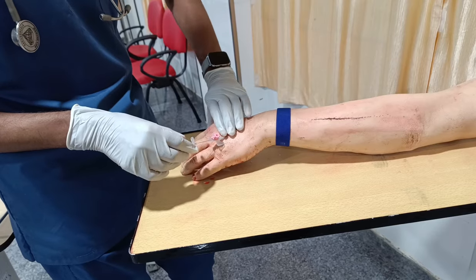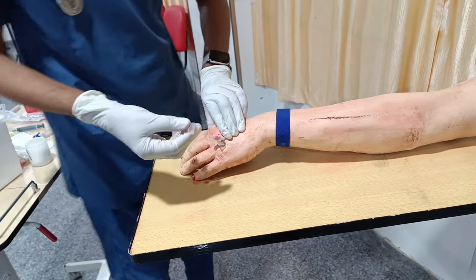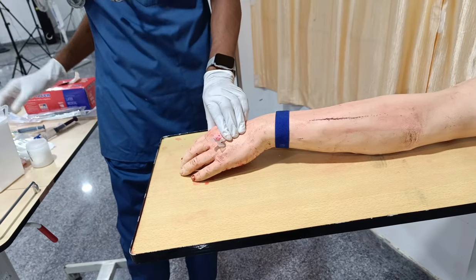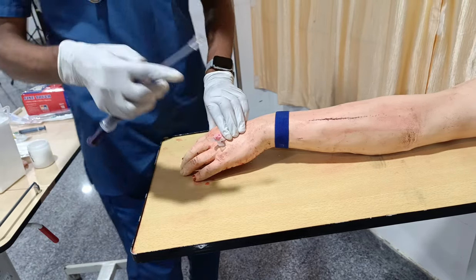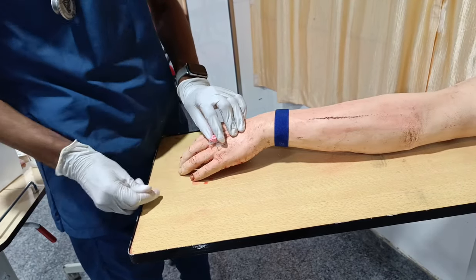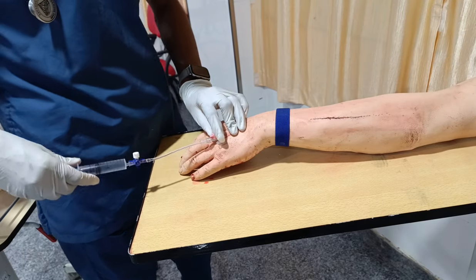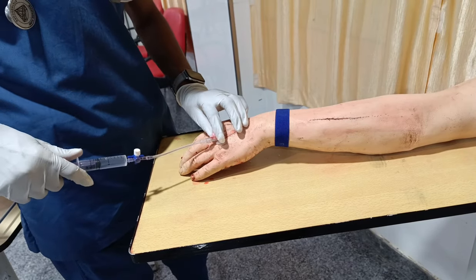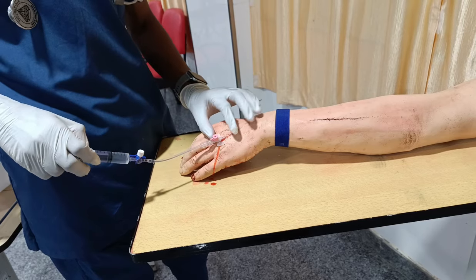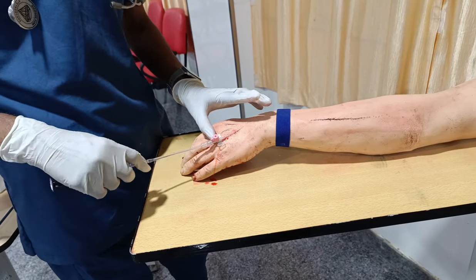So this is the way I have to occlude this distal portion. I have to remove that needle and place it in the puncture-proof container. Then I have to take the pre-filled syringe and attach it, check for the backflow, then introduce it into the circulation. Before that, you have to ask the person if they are feeling any pain or irritation.